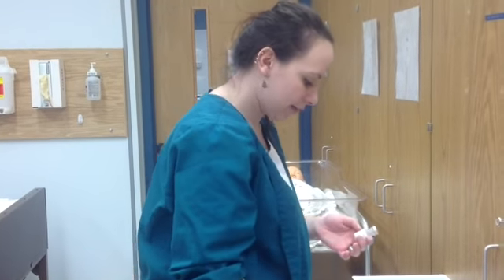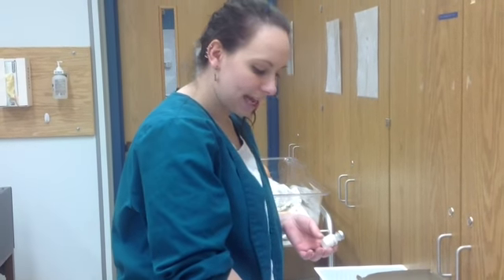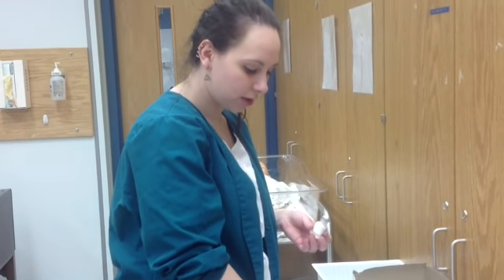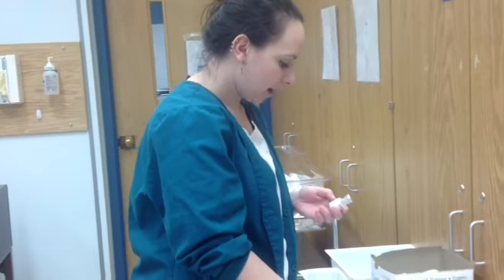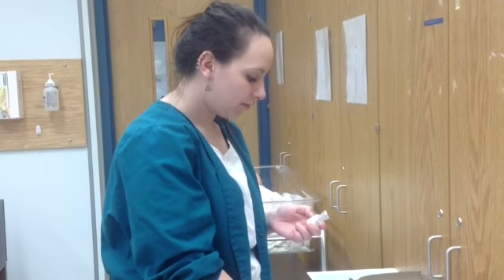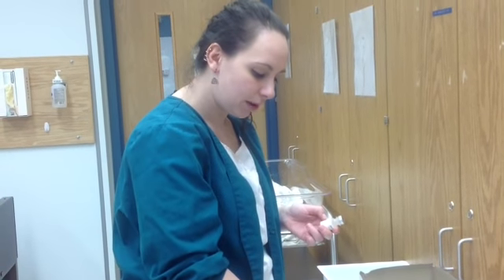Right here, I have a benzathine penicillin, also known as Bacillin. So I want to make sure that I have all the names correct. So this is labeled as Bacillin. It does match up. This one, the expiration date is intact. I'm also going to check for the dosage. So this says I need 2.4 million units.